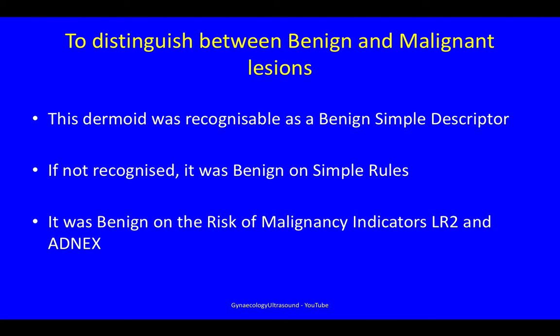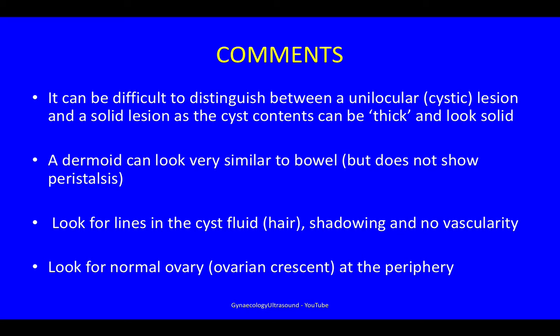It's important to be able to distinguish between benign and malignant adnexal lesions. This dermoid was recognisable as benign using a simple descriptor. If it was not recognised immediately, it was benign on simple rules, and equally benign on the risk of malignancy indicators LR2 and ADNEX. It can be very difficult to distinguish between a unilocular cystic lesion and a solid lesion, as the cyst contents in a dermoid can be very thick and look solid. A dermoid can look very similar to bowel but doesn't show peristalsis.